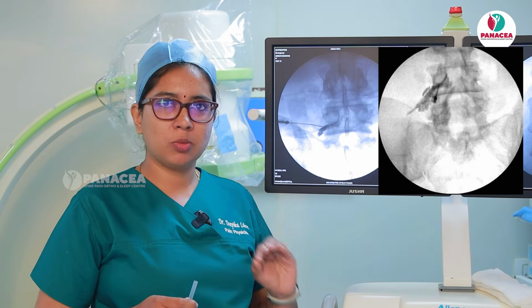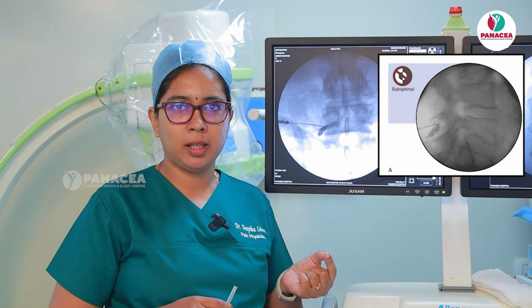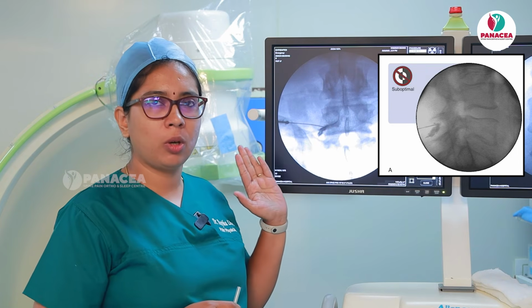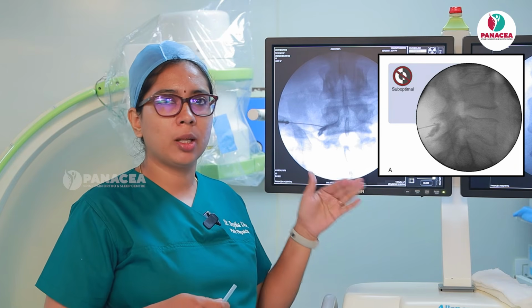That's why, as we have told again and again, initially give only 0.2 to 0.3 ml of dye, so that your working field, you are able to see it better, so that it is not marred by the dye spread and you are not able to see anything.